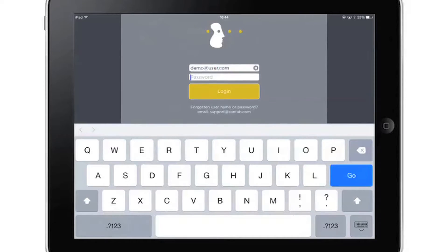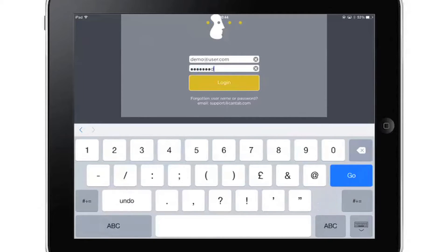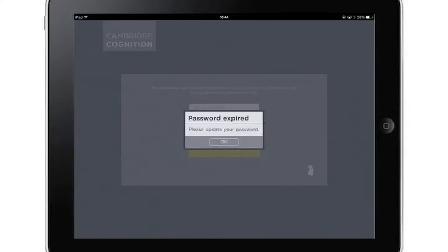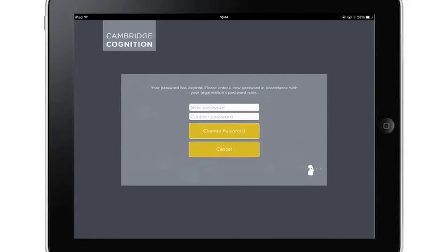First, log in to Cantab Connect using the login email address and password provided. After the first log in, you will be asked to change your password in order to make it something memorable and secure.